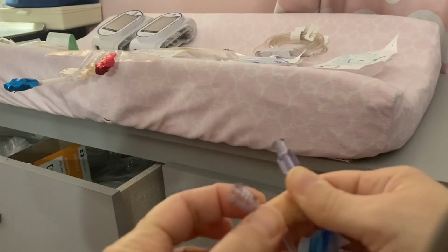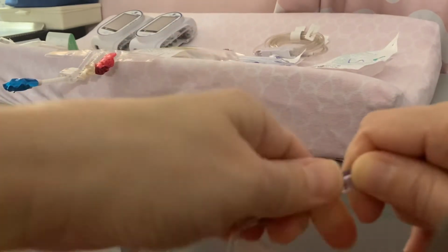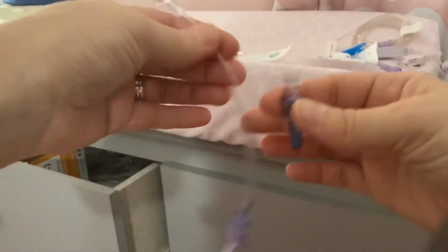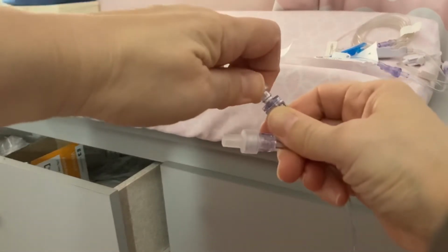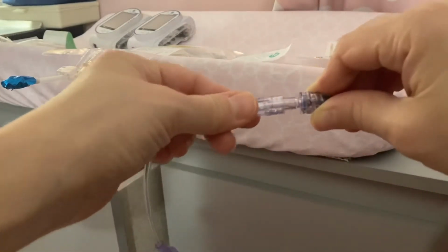You will see the connections are male and female. Carefully connect the 2 ends and push the plastic casing over the connection and twist until it is snug. Repeat this with the next tube and filter set. Lastly, take the clear filter tube and the anti-siphon valve. Place in your hand the same way you did earlier and connect them together. This anti-siphon valve will be the piece that actually connects to her central line. It prevents blood backup.